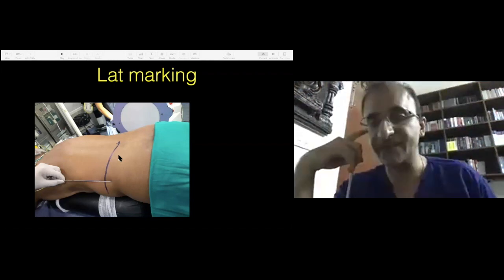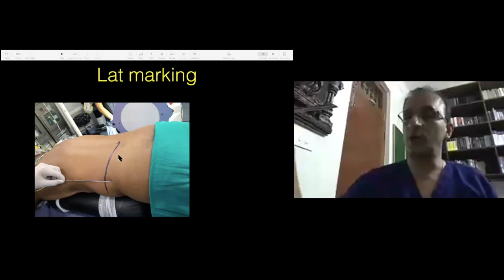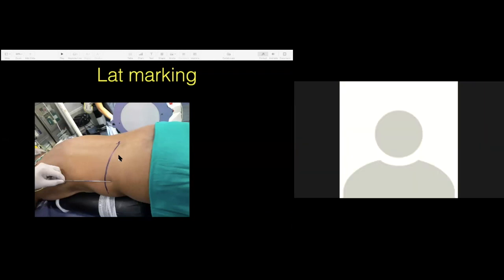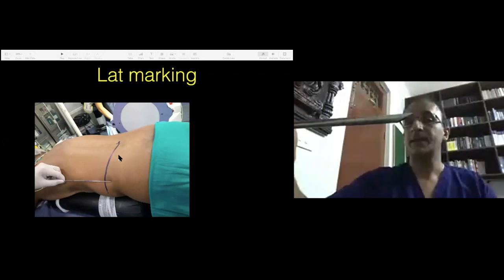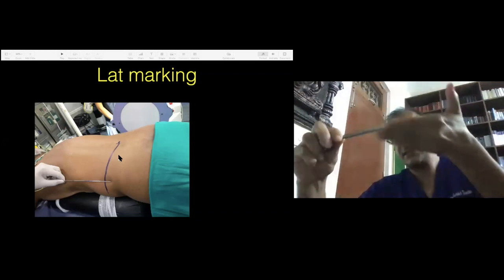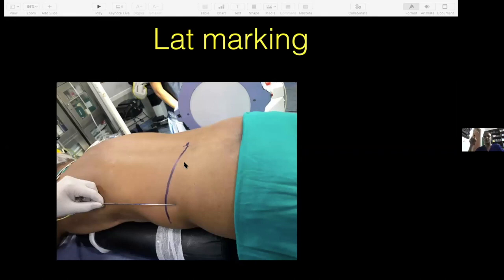Who was asking this question? Vinayak. Yeah, Vinayak, so your needle will go like this. If you are not comfortable, you just rotate the bevel of the needle down. When you are inserting and your needle is going up, it will automatically flow up because these structures here push the needle to go up. It doesn't go straight. So that is point number one, how to use the bevel of the needle.